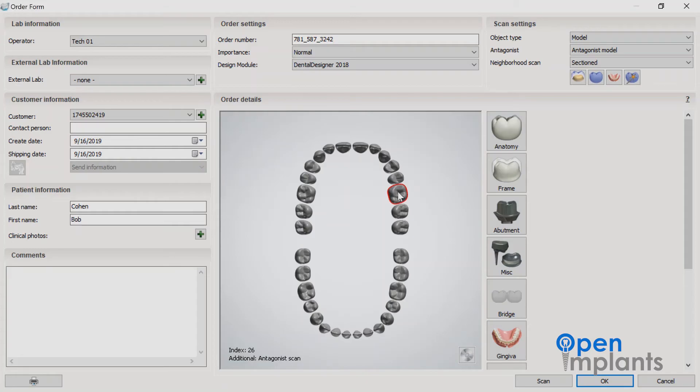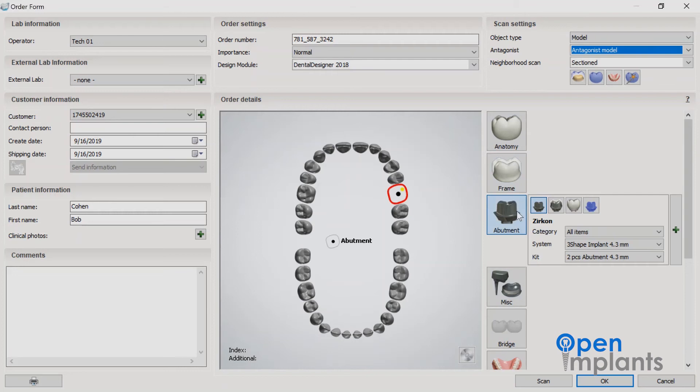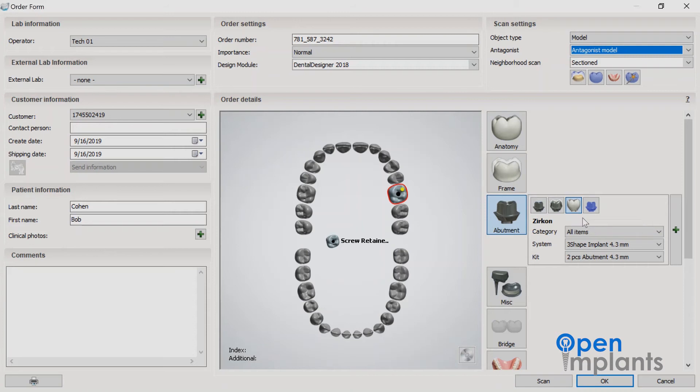Now that you're in the three shape order form, go ahead and select the tooth number. Then you're going to go to the screw retain option because we are creating a screw retain crown. Select the category option.